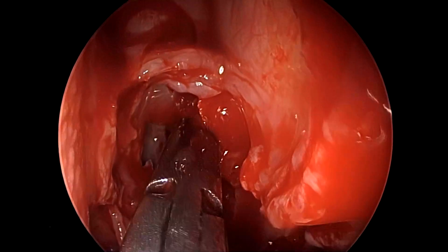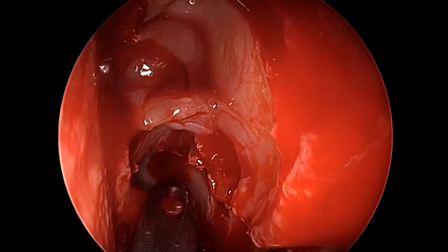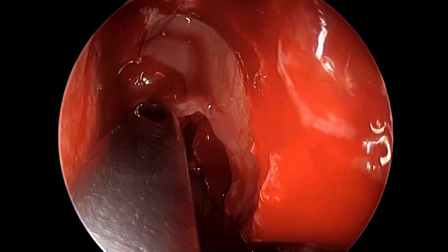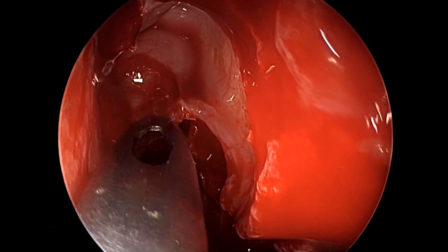So we see here that we are using a blunt dissection to break the bony septations to get behind the meningocele comfortably and to clear all the excess bone and mucosa while not penetrating the meningocele.